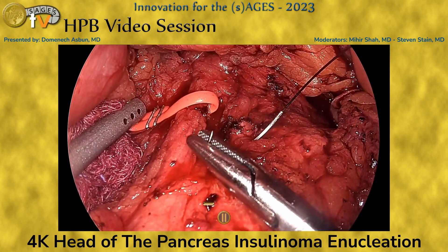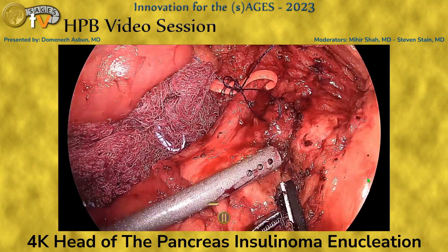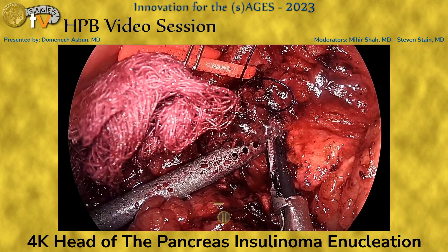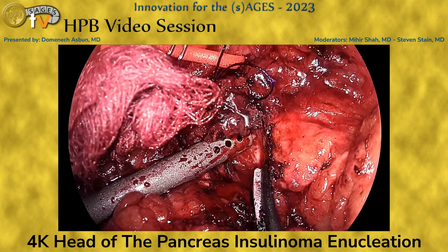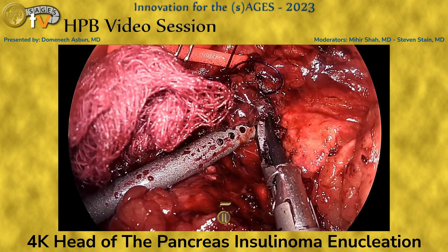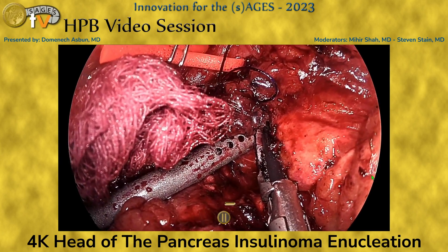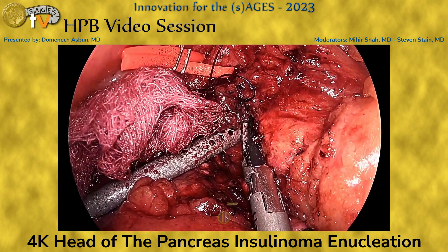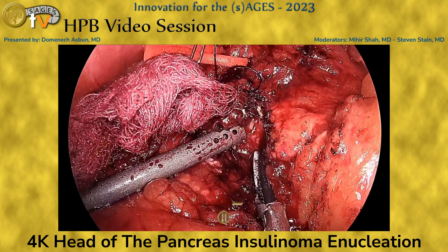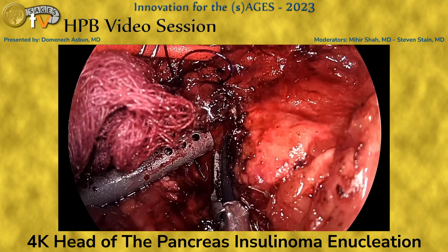We use a retraction stitch overlying the mass to help manipulate it as we begin the resection. We go back and forth with the ultrasound as necessary to confirm the dissection plane, and use the harmonic scalpel to do the majority of the dissection. Early on, we avoid the temptation of being overly meticulous with hemostasis — this is a hypervascular lesion, so we allow a little bleeding rather than obscure the dissection plane, with maybe a little direct pressure as needed.